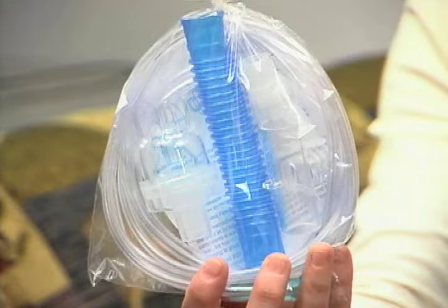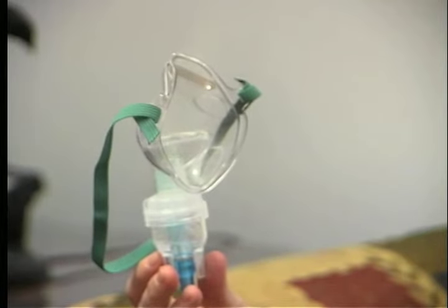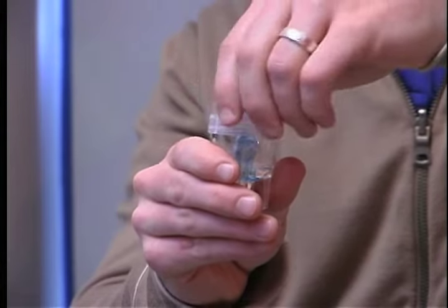It is a good idea to keep an extra nebulizer on hand in case there is damage to the one you are using. Frequently check the nebulizer for cracks and medication buildup inside the cup. If the treatment takes longer than usual, check to see if the nebulizer is misting. If it is not, the nebulizer may be clogged or the compressor filter may be dirty. If the treatment is shorter than usual, make sure the medicine is not leaking out of the cup. Either the cup is not screwed on correctly or there is a crack in it.